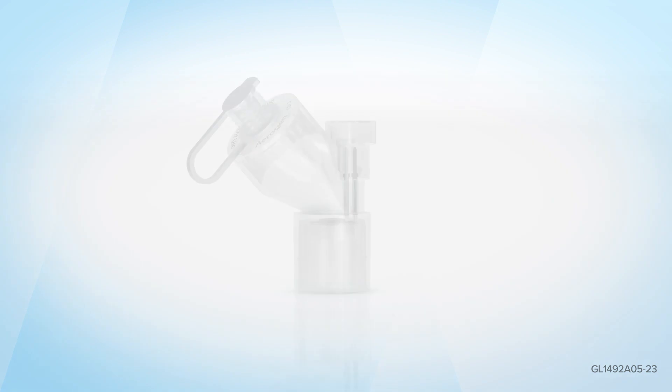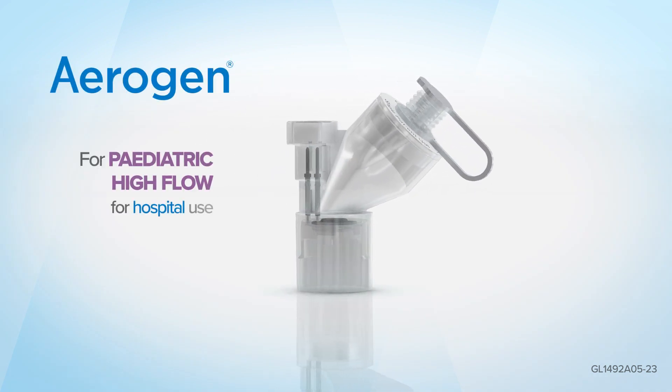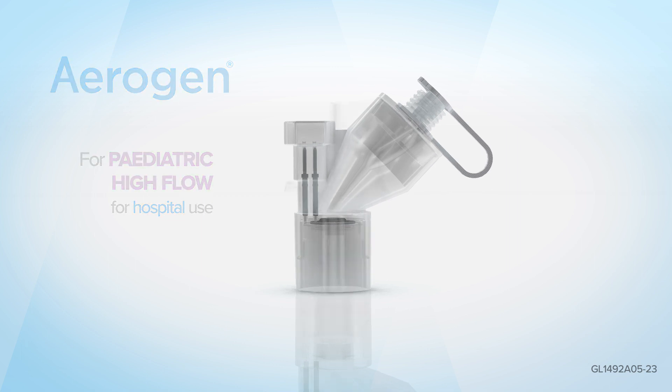This is an example setup of Aerogen for paediatric high flow for hospital use. Please consult individual manufacturer's instructions for use, as setups may vary.